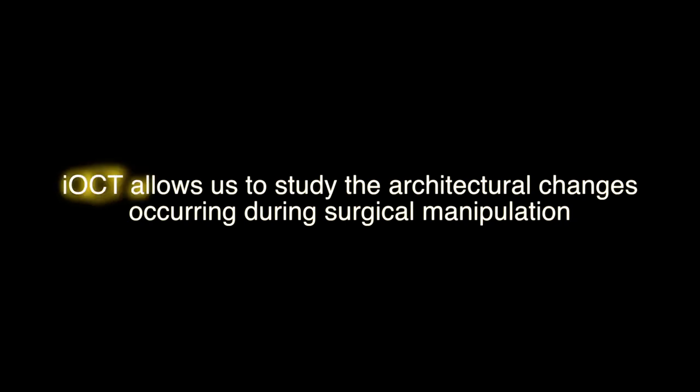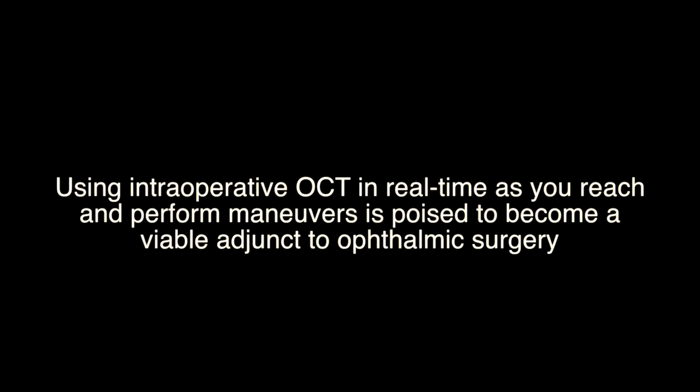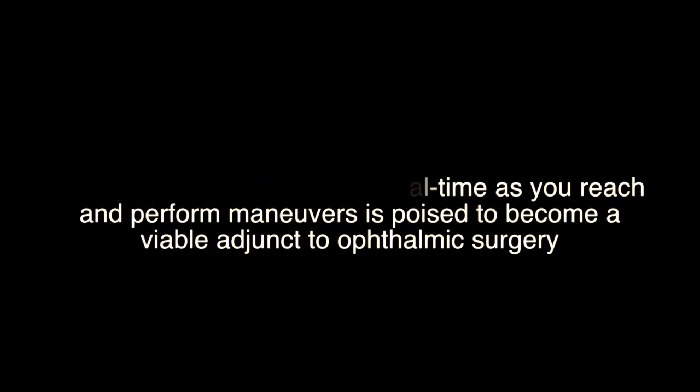Surgery is a dynamic process, and intraoperative OCT allows us to study the architectural changes occurring during surgical manipulation. OCT has already revolutionized the clinical practice of ophthalmology. And by using intraoperative OCT in real time as you perform maneuvers, it is poised to become a viable adjunct to ophthalmic surgery.